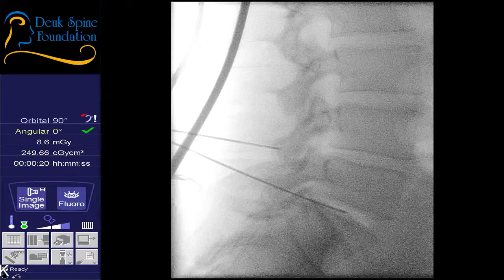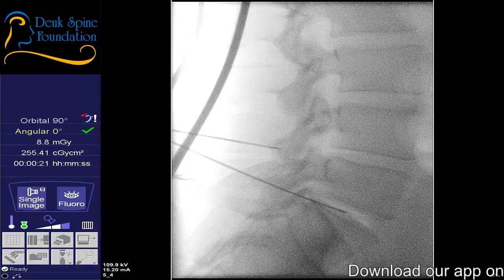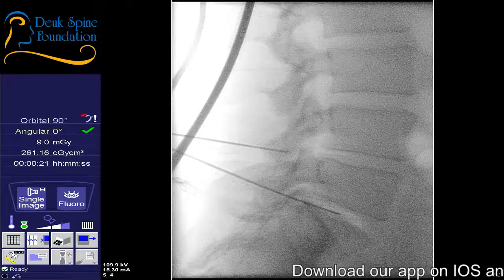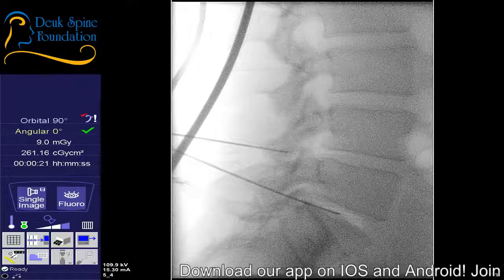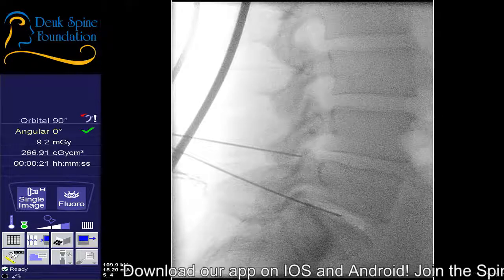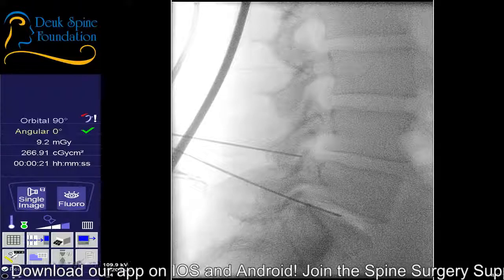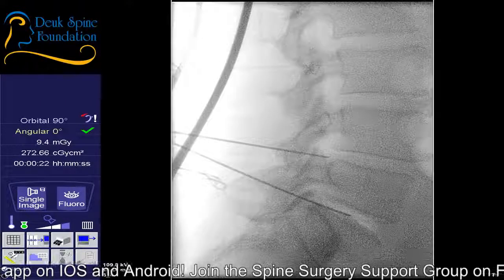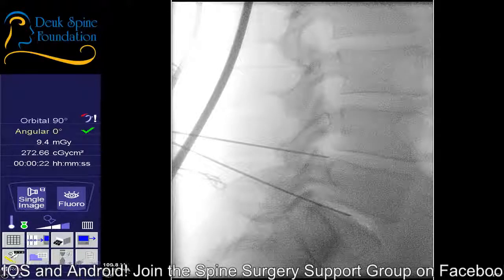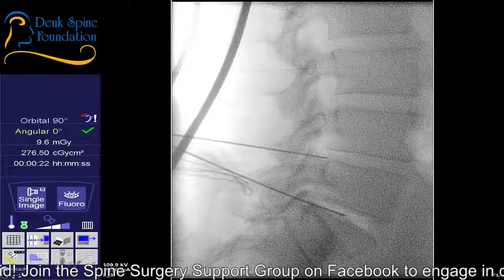This is an actual surgery. We're using a knife, we're making an incision. Shot. We're using surgical tools. You can't use surgical tools through a needle. It doesn't work. Shot. You actually have to do surgery, which is why it's a surgeon doing the surgery, not a pain management doctor. Shot. Pain management doctors generally do needle procedures. Feel anything there?